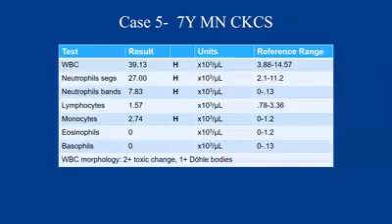So if we go back and do our differential, all right, this patient has a leukocytosis that's primarily due to a mature neutrophilia, but there is a moderate left shift in this patient, supporting inflammation, and we do have some toxic change present, again supporting inflammation. I didn't show you any pictures of monocytes, but the patient also did have a monocytosis, part of the inflammatory response.